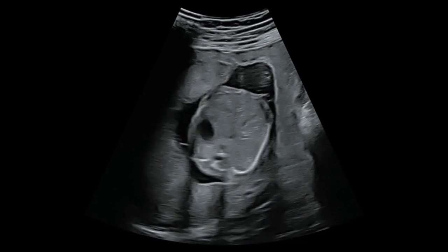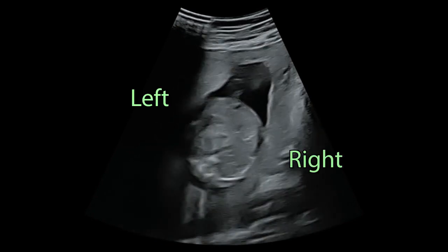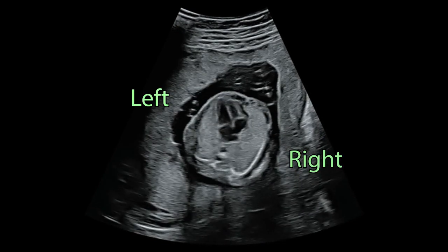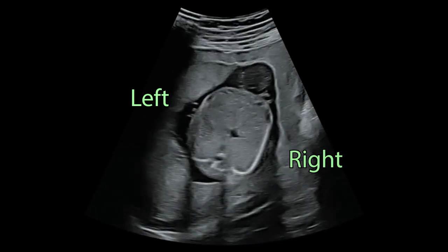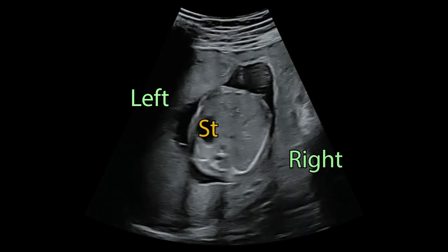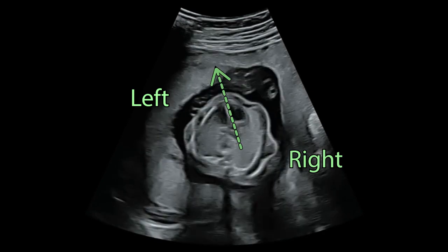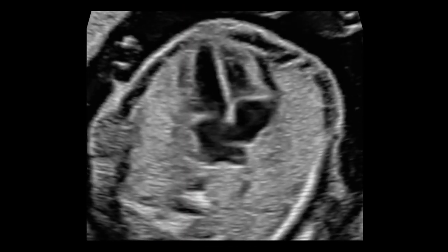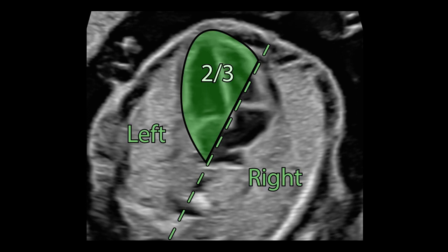The study of the Four-Chamber View starts with a correct identification of fetal laterality. An abdominal transverse cut shows the left-sided stomach. The heart is pointing to the left, and two-thirds of the heart is on the left side of the thorax. This is called levocardia.